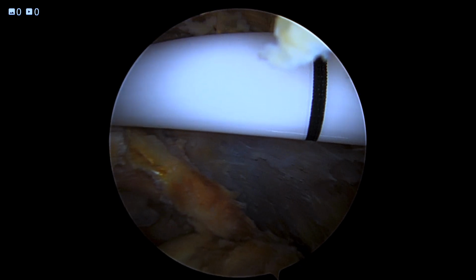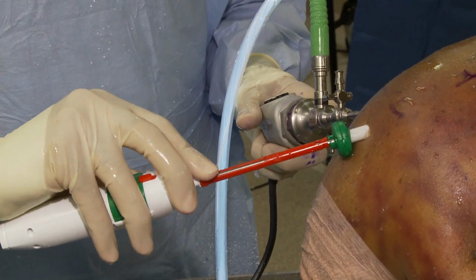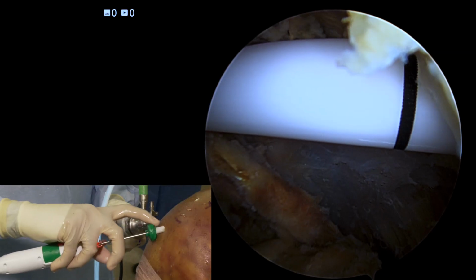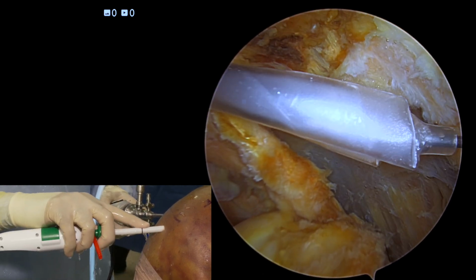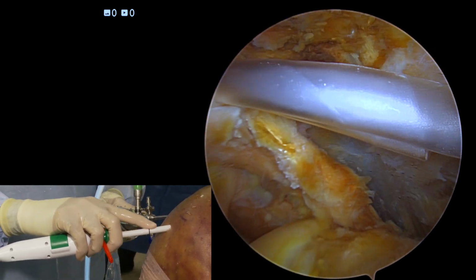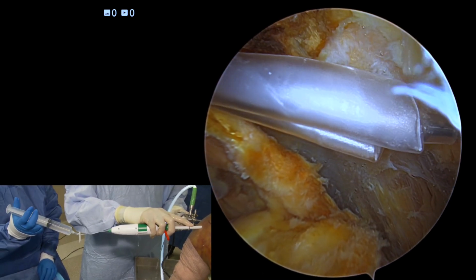Once we've got the saline in place and we're comfortable with the position of the device within the subacromial space, we're going to release the backstop protection, slide it down, and I'm going to slide back the sheath, which is now going to expose the balloon. And again, with clear visualization, I can clearly see that the implant is within the subacromial space and in the appropriate position.